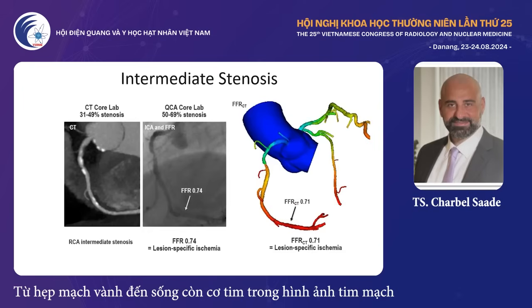When you're also looking at an intermediate stenosis, so for example, here in CT you have a nice, you have multiple calcifications. When you went to the cath lab or into interventional radiology, your FFR distally was 0.74. Definitely this patient does need to have PCI.